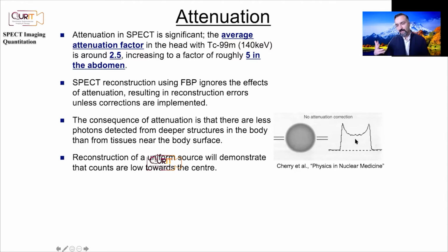And in the past, clinicians have gotten used to these ideas, and so they adjust their reading, their mindset, to sort of correct for this. But the thinking is our job as physicists and as engineers is to design systems that give you more reliable numbers, so you don't have to do that mental adjustment in your mind.